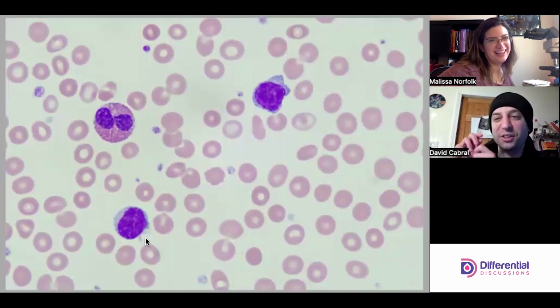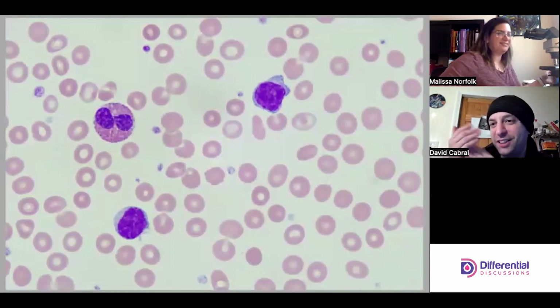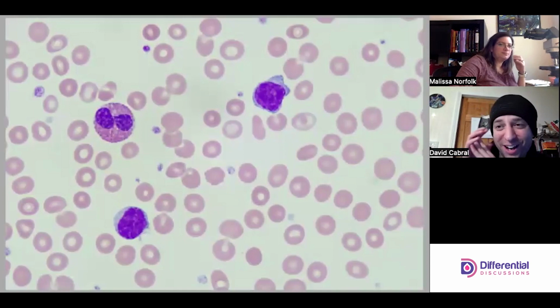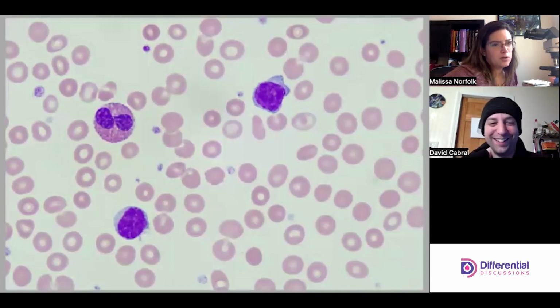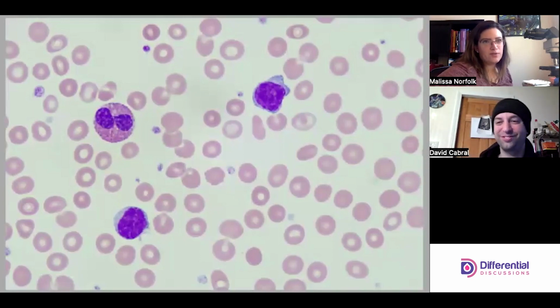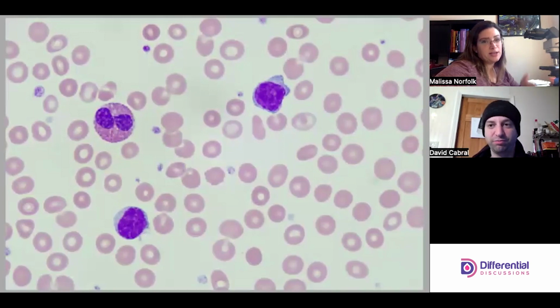I kind of love it because we're peeling back the curtain a little bit, right? As instructors, I would never want to make a student make a call off of that one particular cell. That's really cruel. You want to give a beautiful one, obviously, where I'm looking for you to call it a hairy cell. It's more like once you're practicing and you run into these, and you're like, oh.